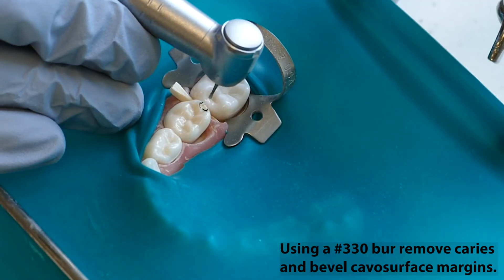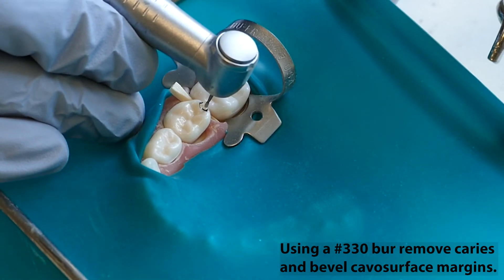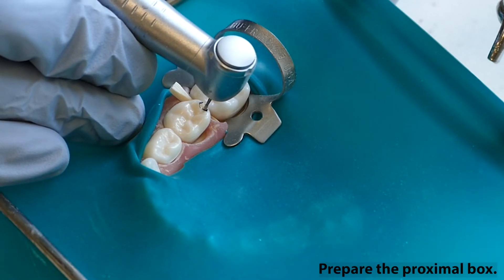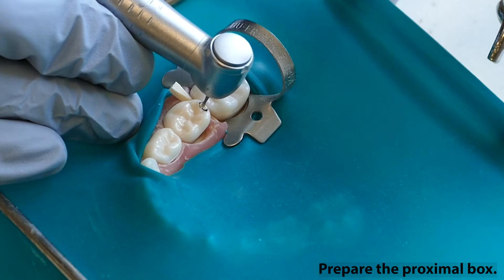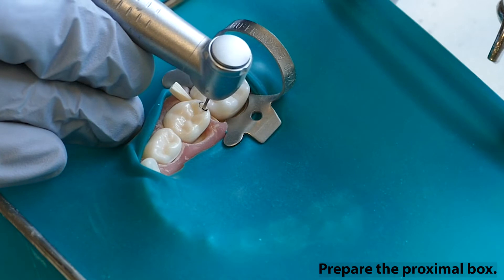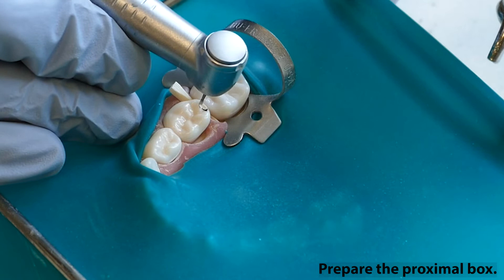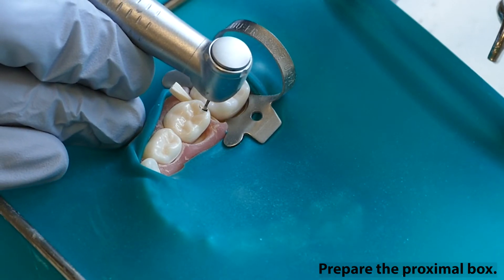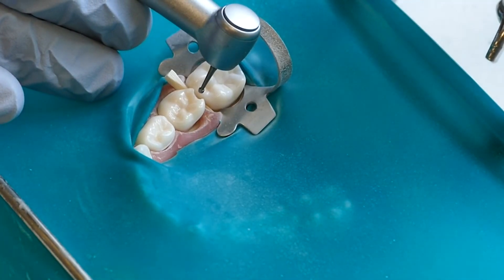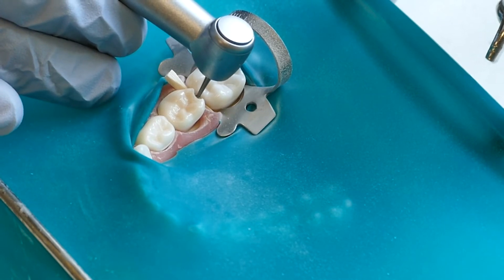Using a number 330 burr and a high-speed turbine handpiece with a light brushing motion, remove caries and bevel the cavosurface margins. To prepare the proximal box, begin at the marginal ridge by brushing the burr buccolingually in a pendulum motion and in a gingival direction at the dentinoenamel junction. Continue until contact is just broken between the adjacent tooth and the gingival wall and the wedge is seen. If the gingival wall is made too deep, the cervical constriction of the primary molar will create a very narrow gingival seat. Take care not to damage the adjacent proximal surface.